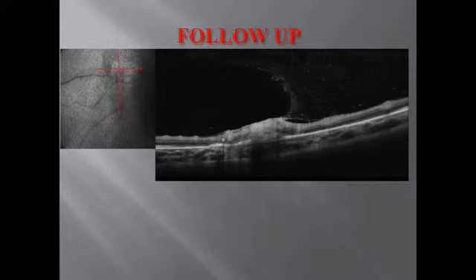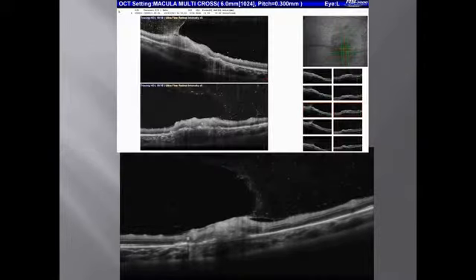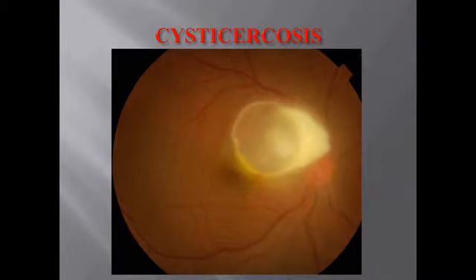Hopefully, we might have a way to grade it. I still have not seen much on that. I would love to have a way that we could grade the amount of cells based on the inflammation. Maybe Dr. Sada might have some answers to that at the end of it. He works a lot on that. So these are some examples of that.